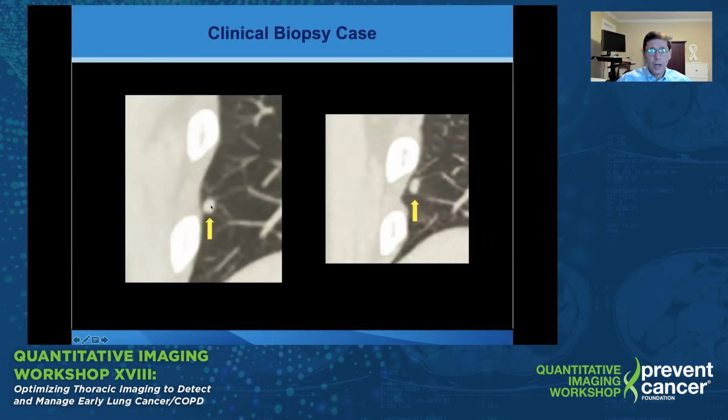And we've seen this clinically. This is time 1 on the left. It's time 2 from Mount Sinai. They got a case with this type of scanner, and you can see that this was referred for biopsy. But it turns out that this is not growth of a nodule from this time point to this time point. This is actually just spatial warping of a CT scan due to the scanner itself. So fortunately, this was caught and the biopsy wasn't done, because that would have been unnecessary.